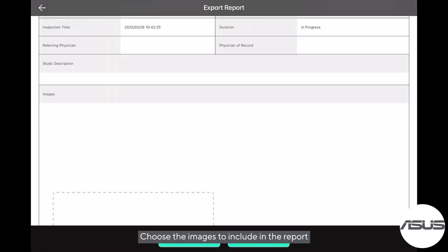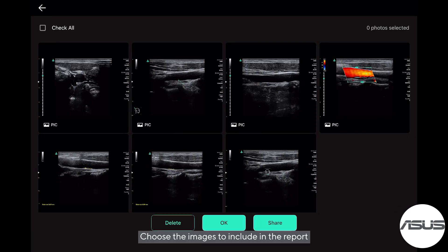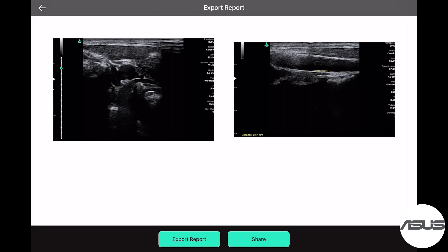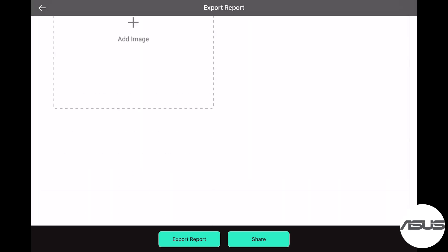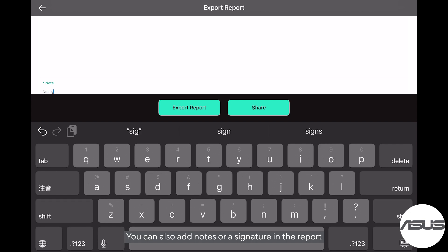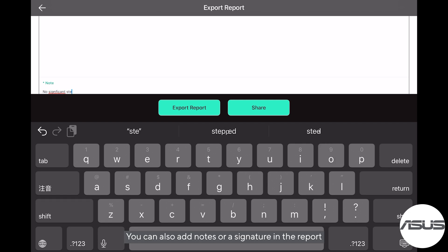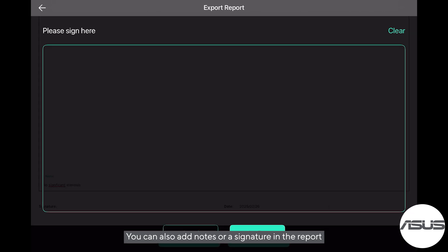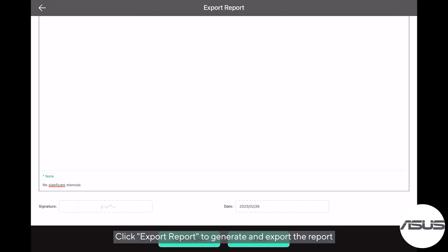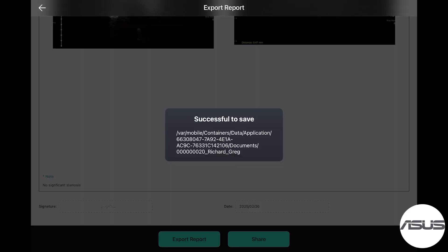Choose the images to include in the report. You can also add notes or a signature in the report. Click Export Report to generate and export the report.